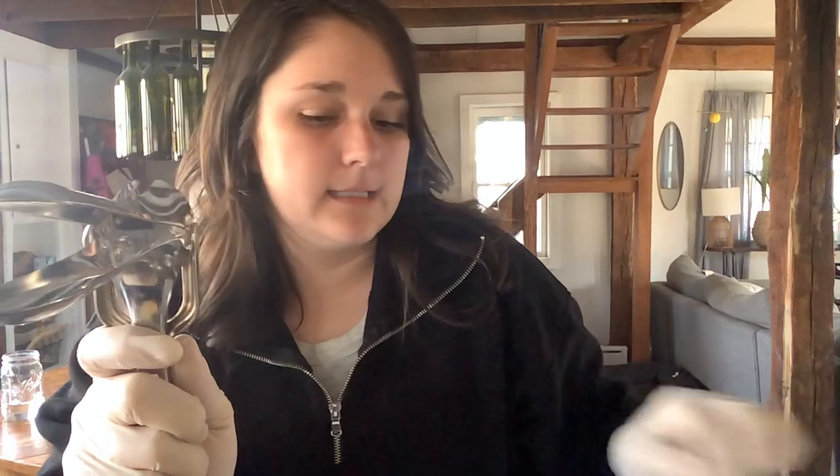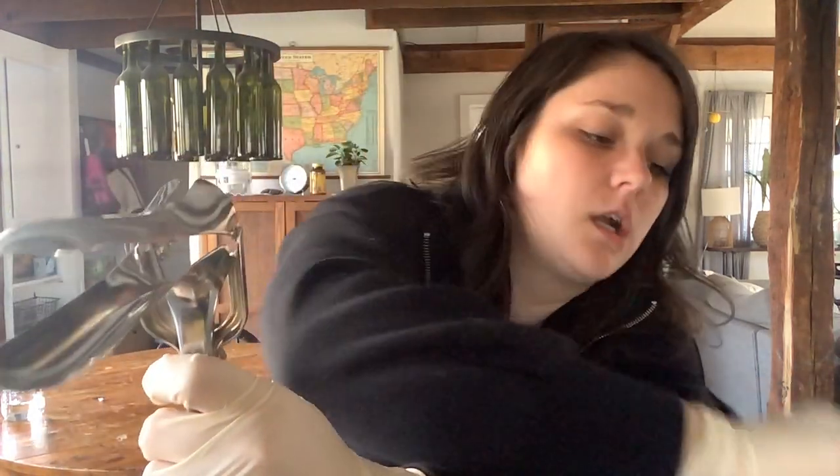So when I'm doing this exam, I'm going to see that I can visualize her cervix. I'm using this broom. I'm entering the broom tip into the cervix and I'm going around 5 times for 5 seconds. So I'm going to visualize this. You don't want to touch this on any other part of the vaginal walls.